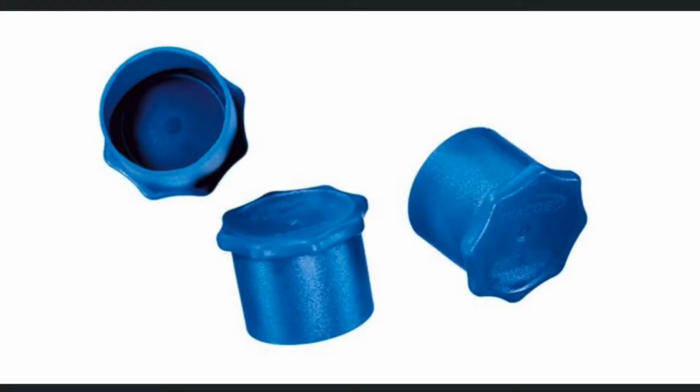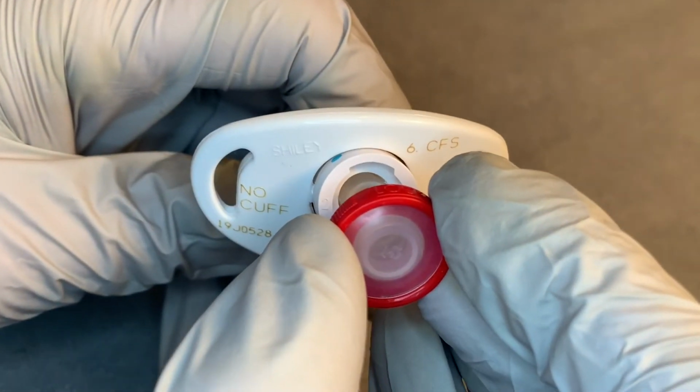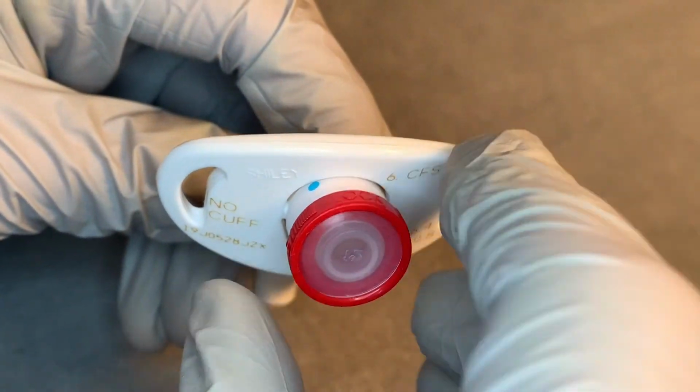When patients are nearing getting their tracheostomy tube out, it is capped or blocked off. While this is happening, you are breathing normally through your nose or mouth and not your tracheostomy tube. The cap varies depending on the model of the tracheostomy tube. Some models are placed on the end of the tracheostomy tube, whereas others require the whole inner cannula to be exchanged. Your physician can talk to you more about capping when you reach that point.